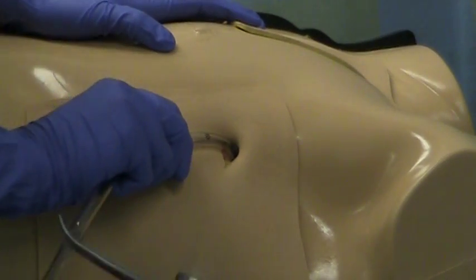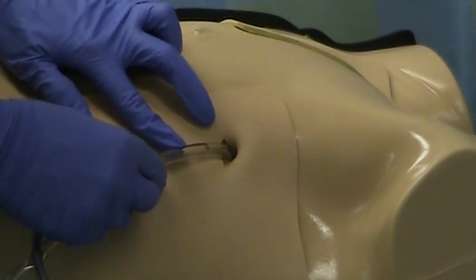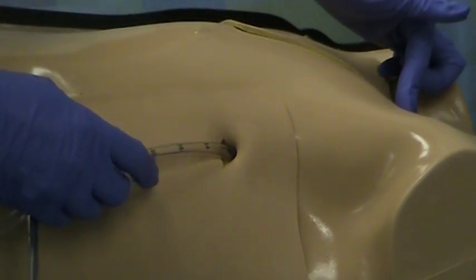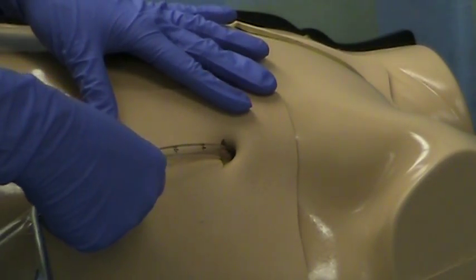Okay, now at this point in time I've pushed it to about the 10 mark, and as I measured earlier it was about 14. But I'm going to give myself a little extra room because I really don't want it hitting the patient up here. It's very uncomfortable for the patient and oftentimes won't work very well.